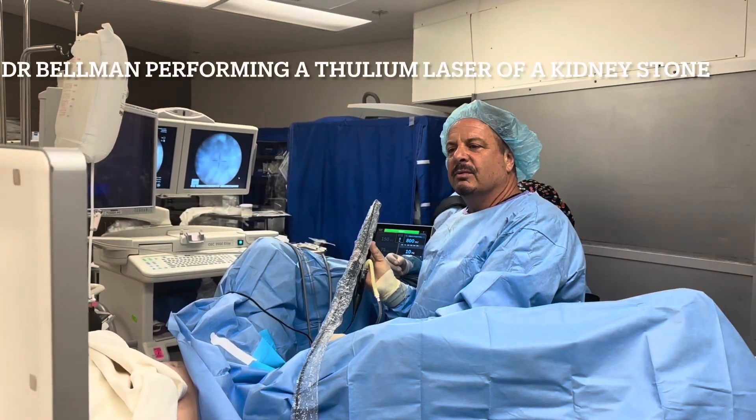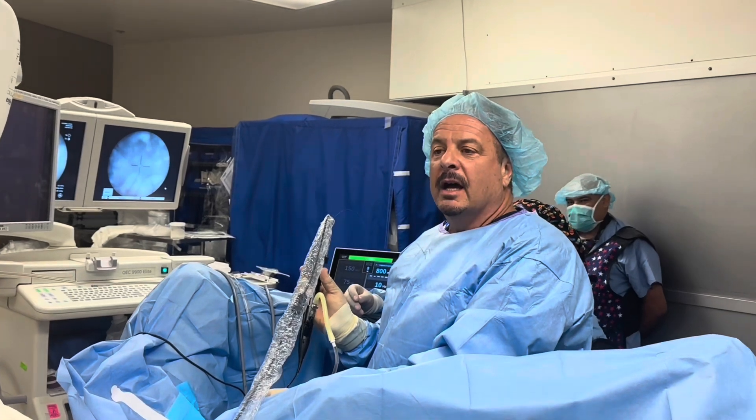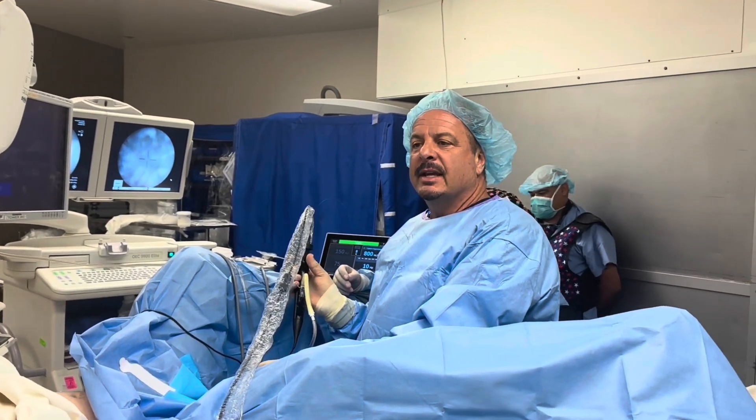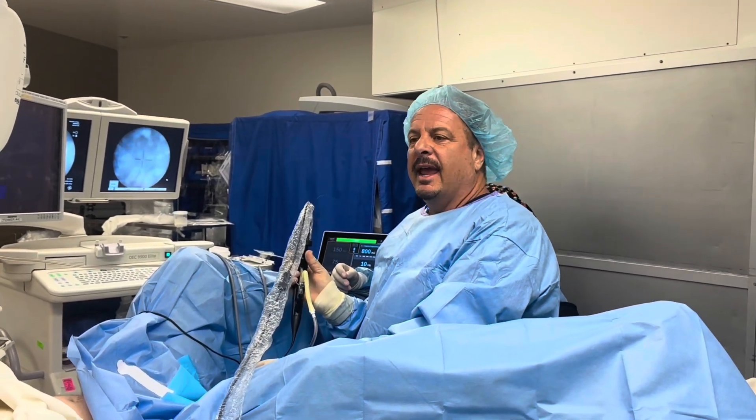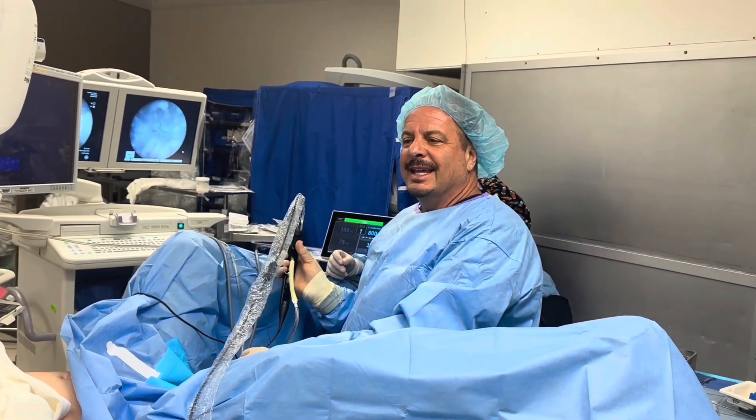Hi, this is Dr. Gary Bellman. We're doing a Thulium laser of a kidney stone. Thulium is the newest laser to break up kidney stones, and shortly we'll show you the internal video of the case.